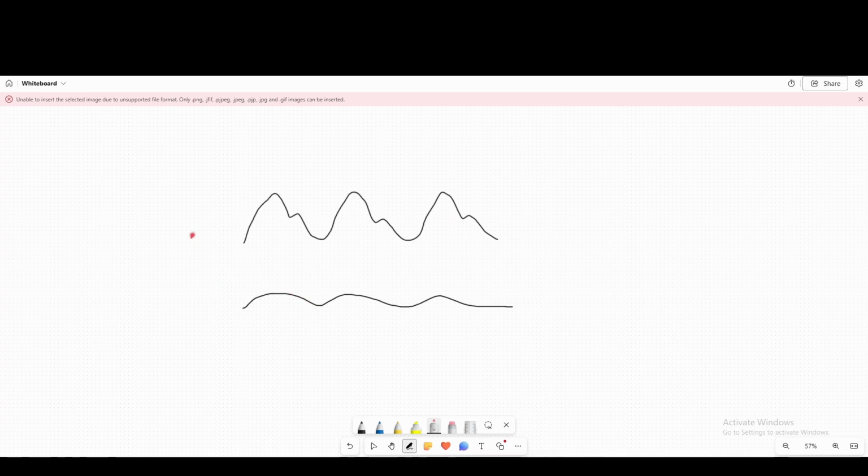Something that people don't think about with pulse oximeters is you can actually tell if one limb is not getting properly perfused compared to the other by swapping the pulse oximeter from limb to limb, finger to finger, toe to toe, and seeing how the waveform and saturation actually change, which I think is pretty interesting. But what can you learn from this? Basically, you can trust this waveform, right?